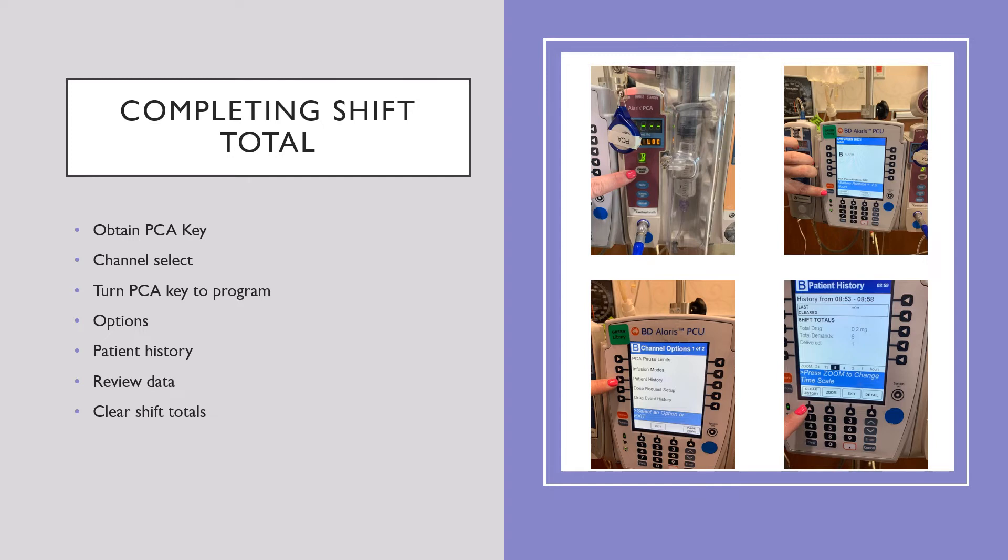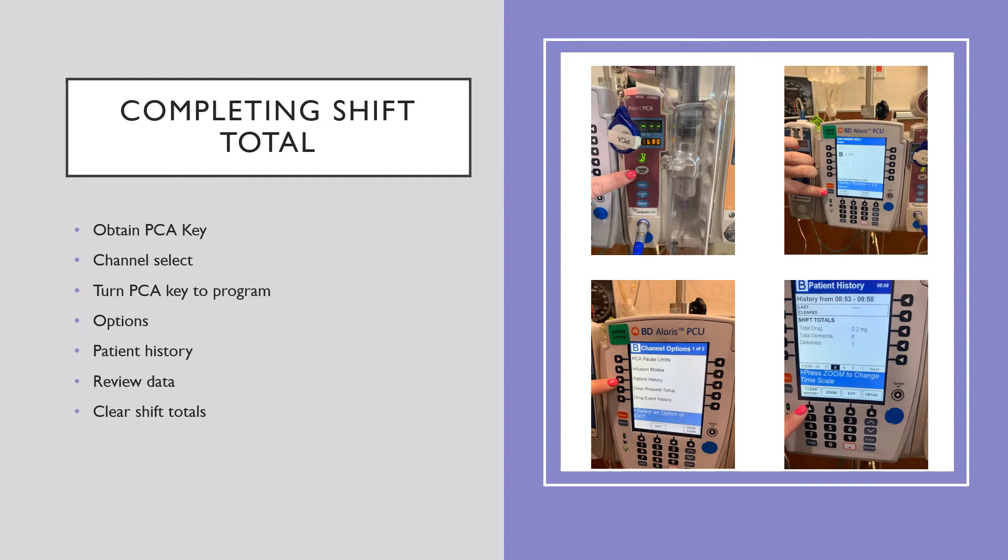Obtain the PCA key. Pick channel select. Turn the PCA key to program. Now pick options, which is on the left hand side. Then patient history. Review the data. And clear shift totals. You should clear the shift totals anytime you're handing off to another nurse, whether it's at 4 hours, 8 hours, or 12 hours.